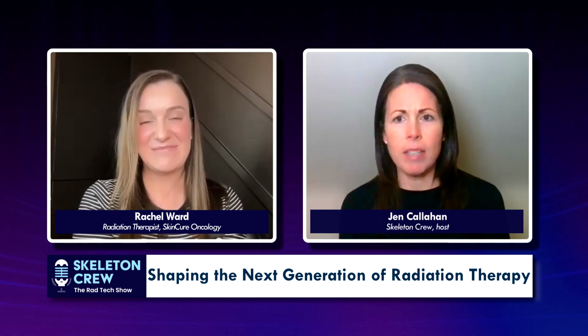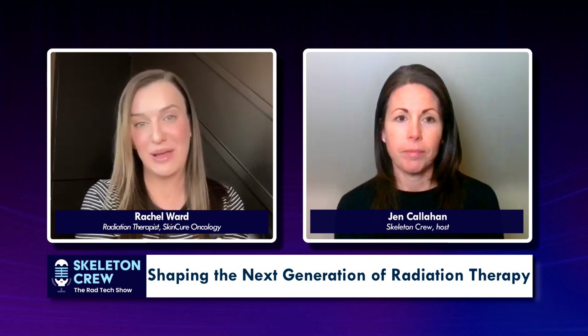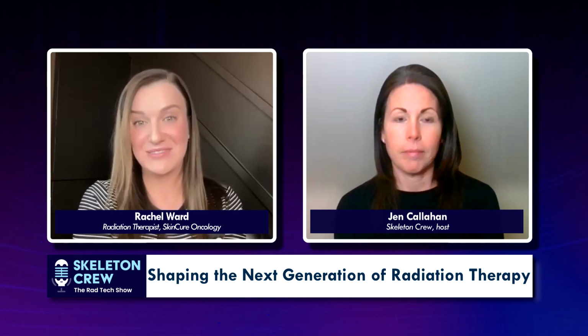Because the eyes are very sensitive to radiation, right? Yeah, we don't want to radiate or give any extra exposure to the lens of the eye. We're always keeping ALARA in mind. So if we have to put the silver shields in, they're getting the silver shields.